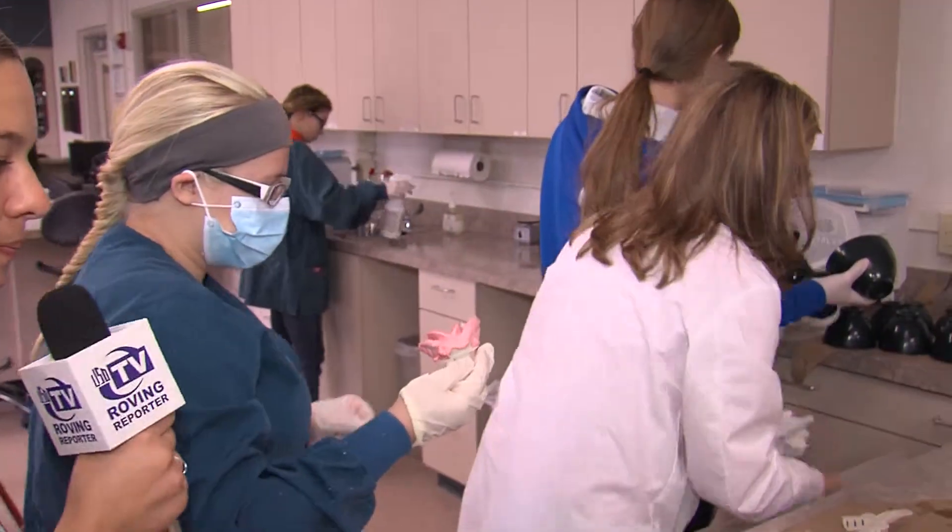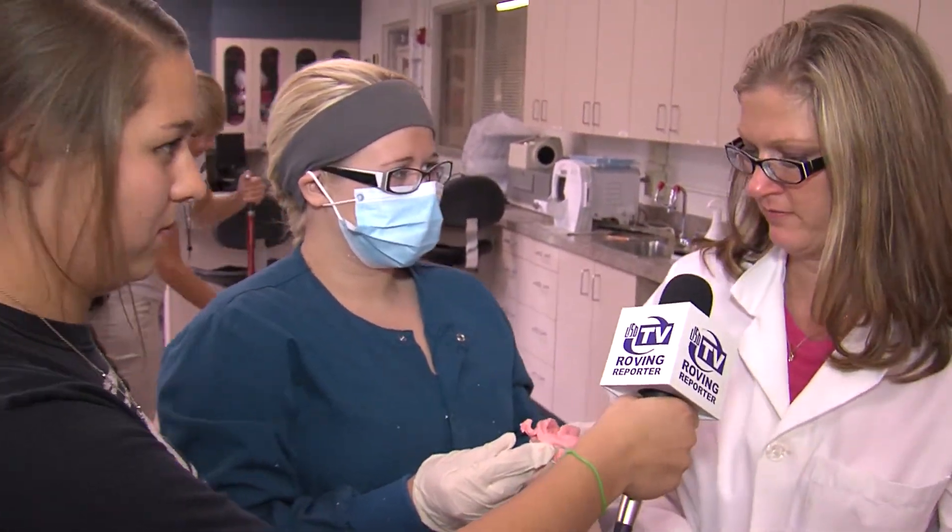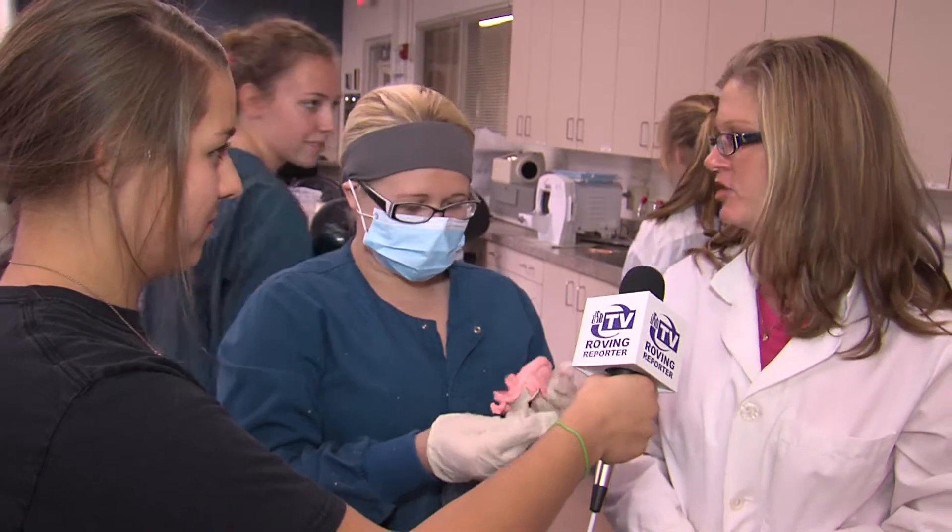I believe it is a good impression. I have to show Mrs. Pilbeam. Mrs. Pilbeam, we have an impression here. What do you think of it? Beautiful. That's perfect. You got everything you were supposed to get. Good job, Hailey.